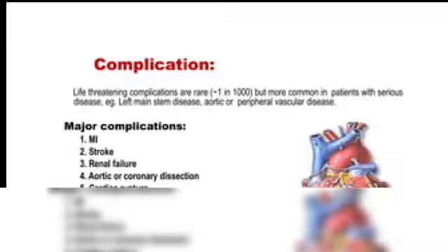A series of X-ray images is taken to check the blood flow in the coronary arteries, and the doctor finally checks for any blockages or narrowing in this area. After completion of the procedure the catheter is removed, and we use a pressure or closure device to stop the bleeding.